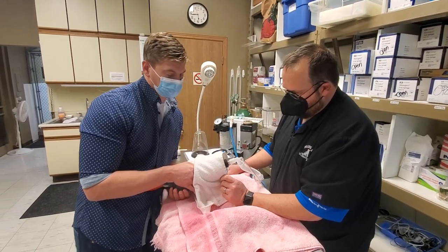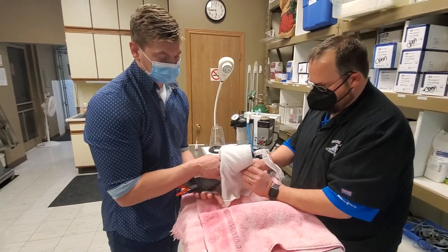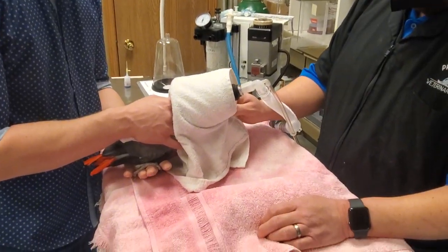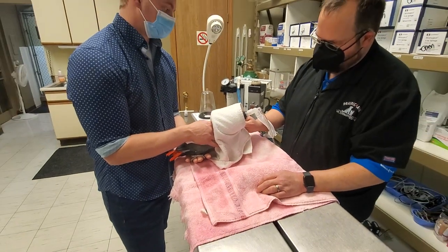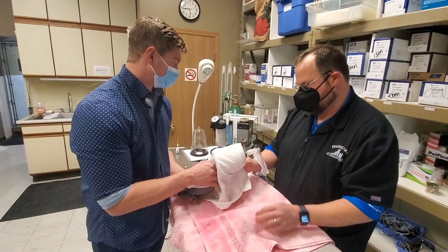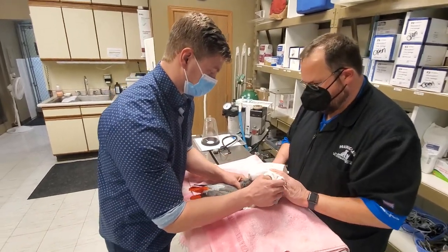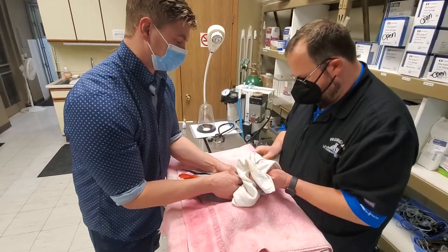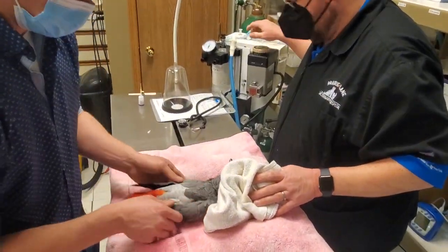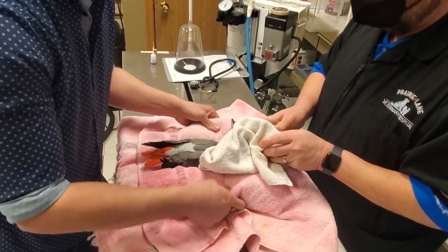Her feet relax in just a little bit. We got heat underneath the towel. This is a very brief procedure, so the entirety of the procedure will take less time than it would to intubate and do everything else. We're just going to leave her with the cone — go ahead and leave her head in the cone. Troy, can you go down to 3% please? Let her rest like this. Roll these up to keep her warm.